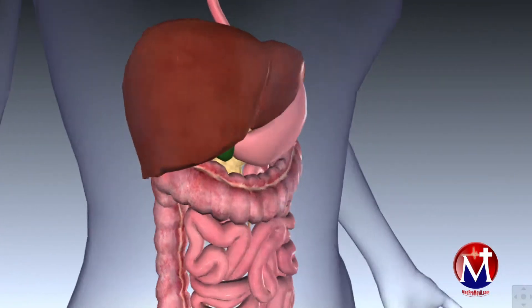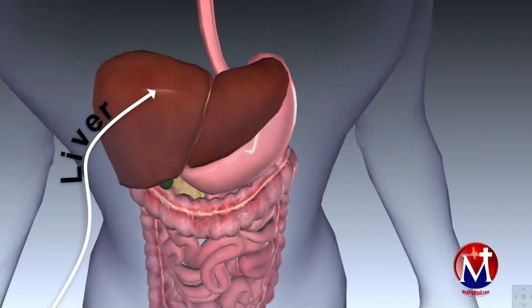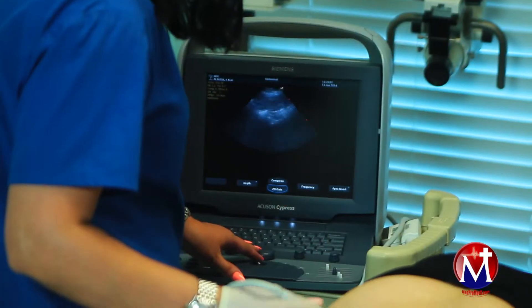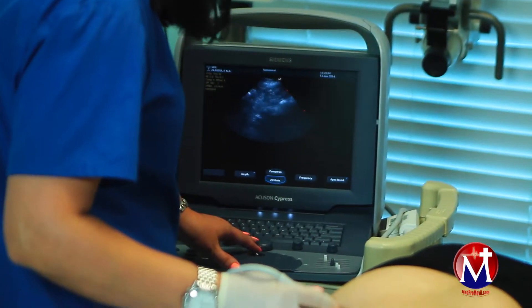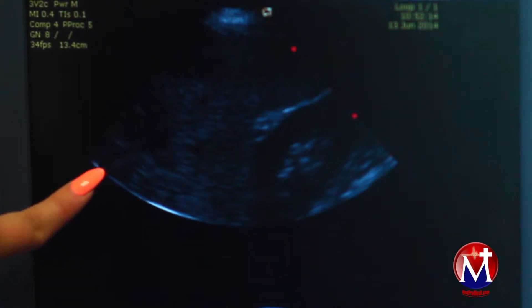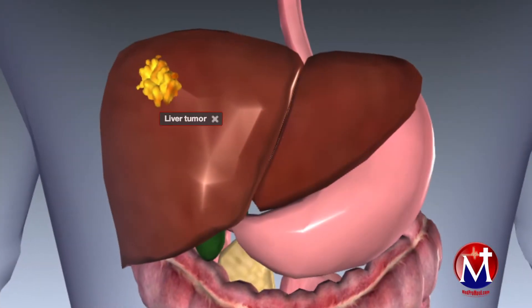Right now she is taking a picture of the liver. We use that to determine the size of the liver, its contours and its texture — to determine if there are any masses, bile duct obstruction, or any changes in the liver texture that could suggest underlying liver disease.